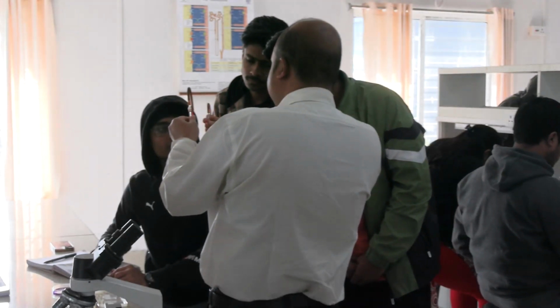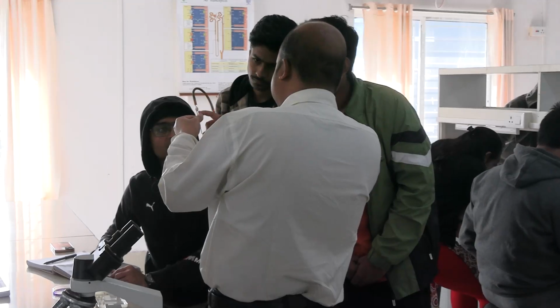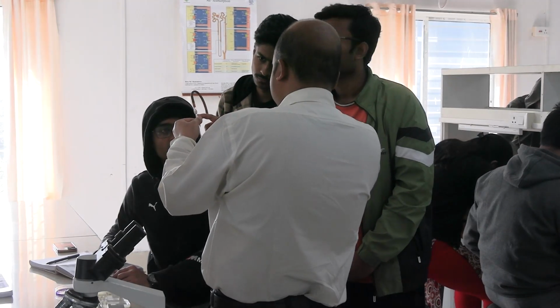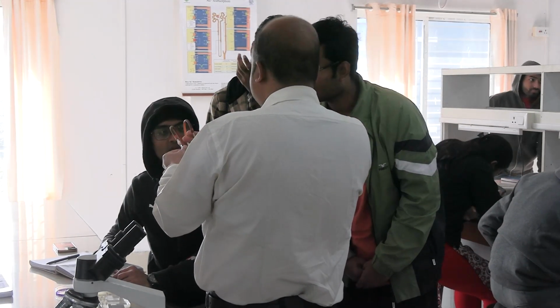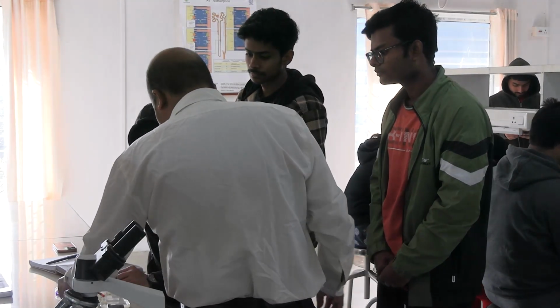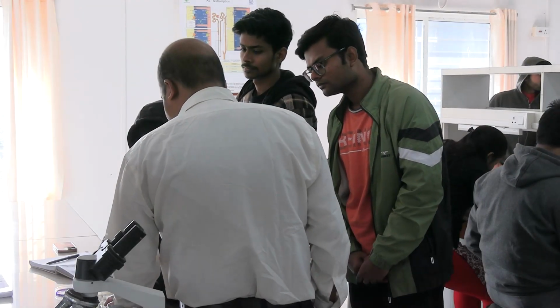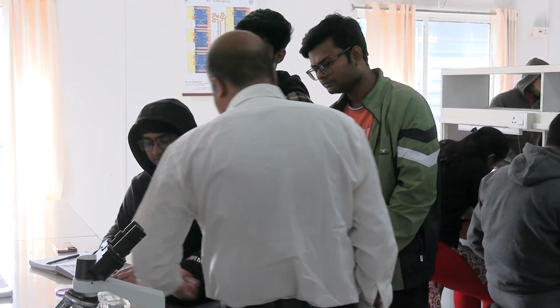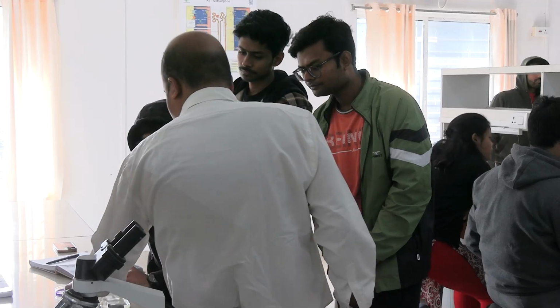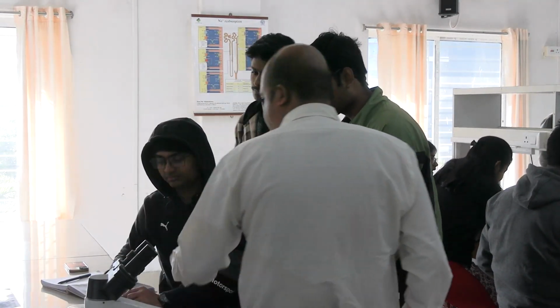101 means this portion contains 100 times the volume of that portion, but in the WBC pipette it is only 10 times. The bulb will always be larger in the RBC pipette. In the hemocytometer box, you can compare and see. For RBC counting, the dilution required is much more. So today you have to work with this WBC pipette. The diluting fluid is Turk's fluid, which contains glacial acetic acid and Gentian Violet.